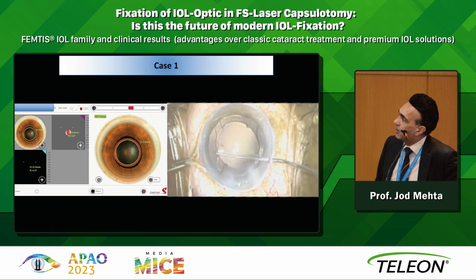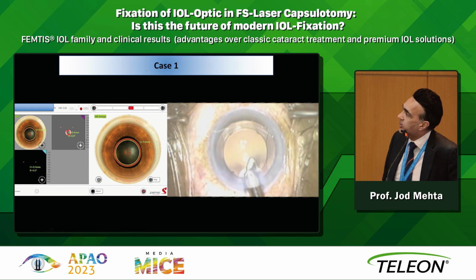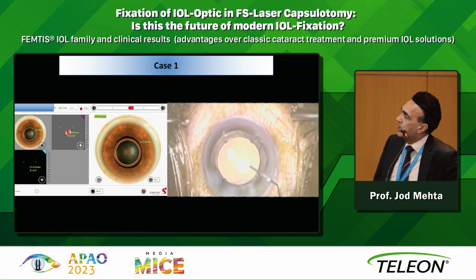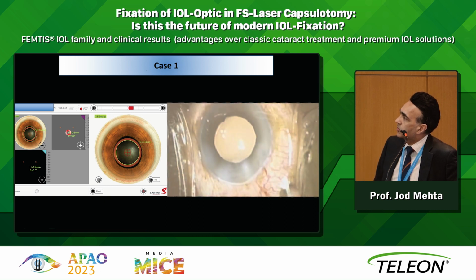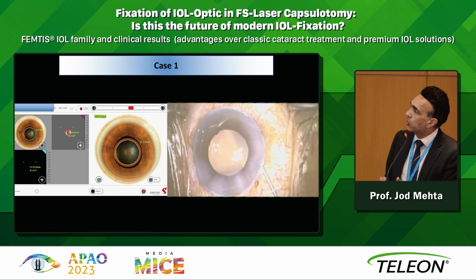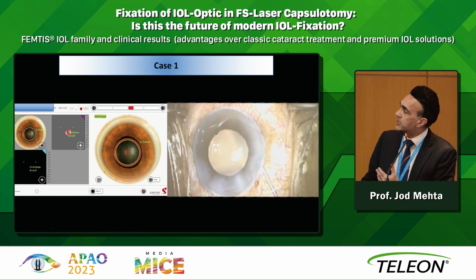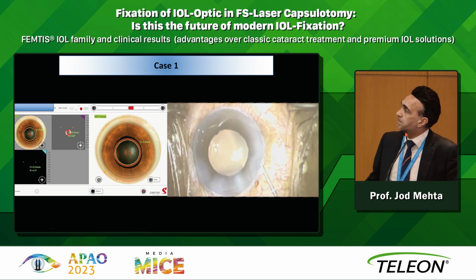And all of these capsules that I will show are all being created with the Z8 femtosecond laser. You can do it manually. I have done it on a few cases manually, but you have to be very accurate with your centration when you're doing a manual capsulotomy itself. And then typically I'll put a bit of Miostat or Miochol inside the eye to bring the iris down. I think it's worthwhile just to make sure that the haptics are nicely in place and there's a gap there between the haptics and the IOL.